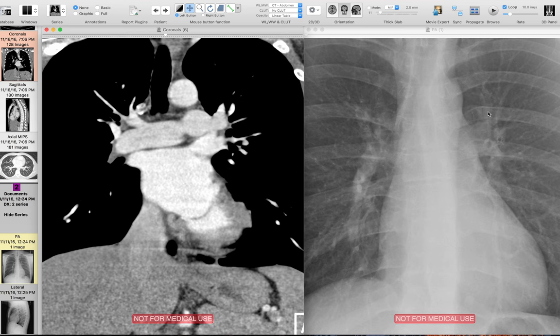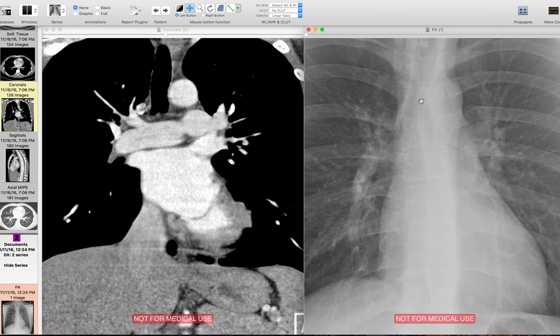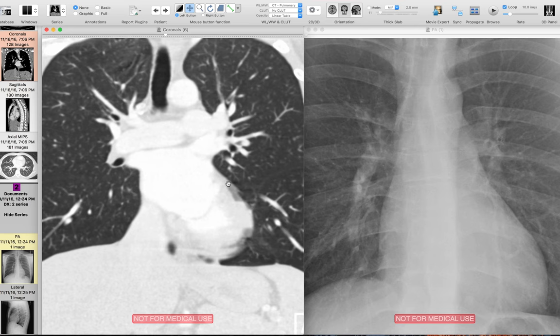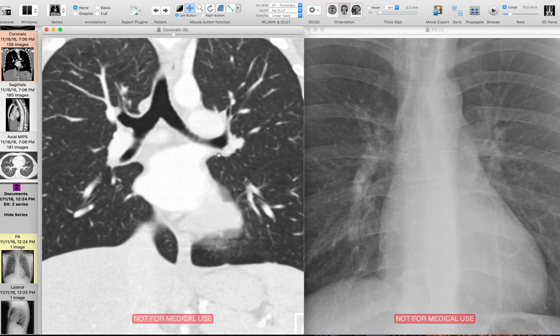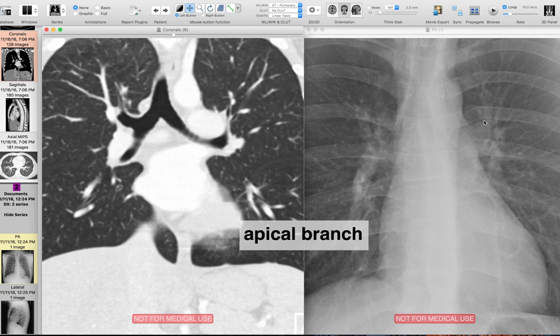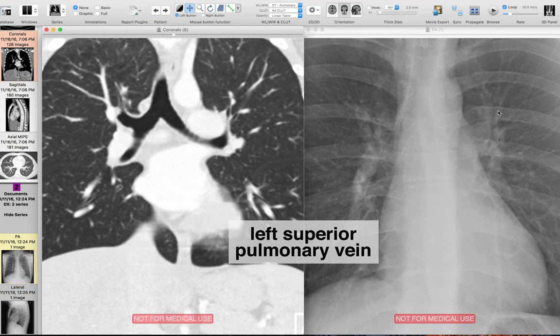There are some bronchi we can see as well. Going back to the trachea: there's the left main bronchus, which continues on to the left lower lobe bronchus, with a branch coming off as the left upper lobe bronchus. On the CT: the left main bronchus continues down into the left lower lobe, and the part going up is the left upper lobe bronchus. To summarize the left hilum: left pulmonary artery, apical branch of the left pulmonary artery, interlobar pulmonary artery, left superior pulmonary vein, left main bronchus, left lower lobe bronchus, and left upper lobe bronchus.